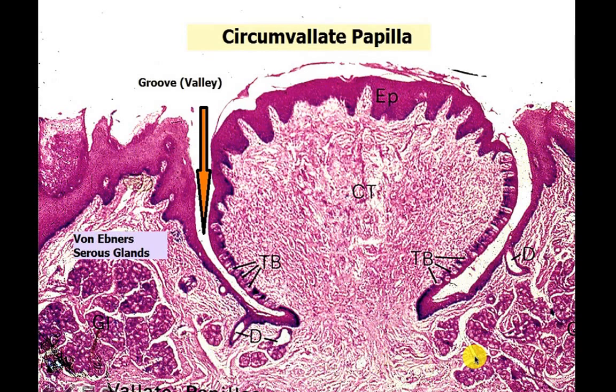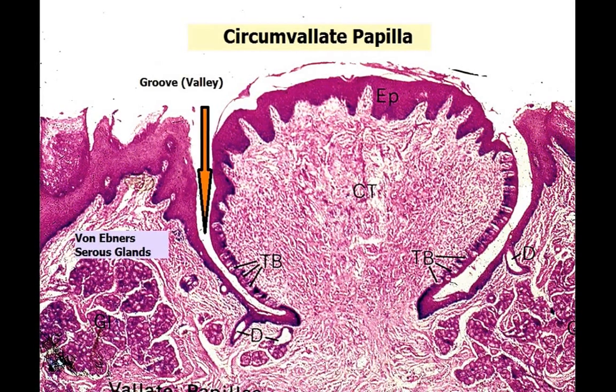These glands, of course, are accessory salivary glands. They share in the formation of the saliva. We have major salivary glands, parotid, submandibular, and sublingual, and we have accessory glands like the labial glands, which were taken in the lip slide, the glands present under the papillae, which are von Ebner glands, and also the lingual mixed glands formed of mucous and serous acini.